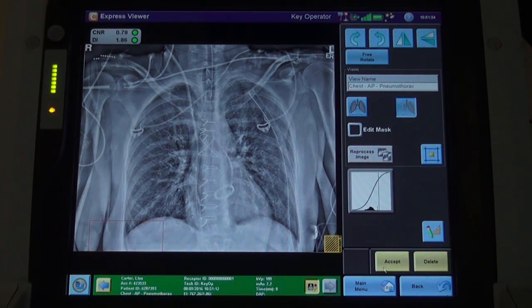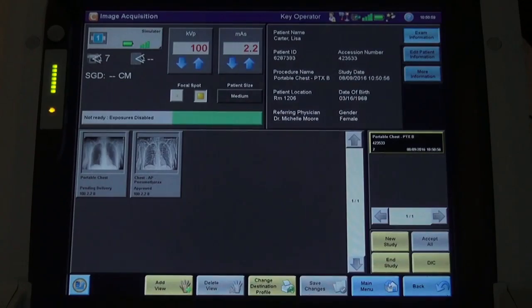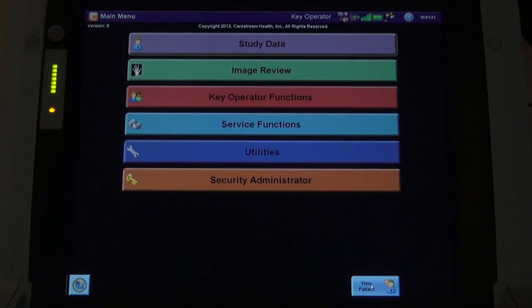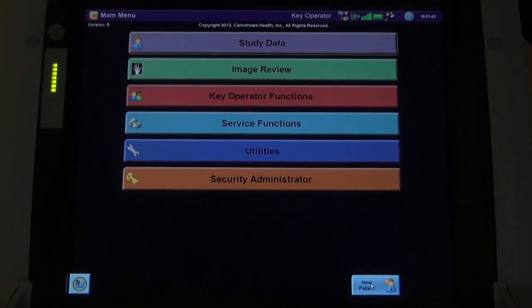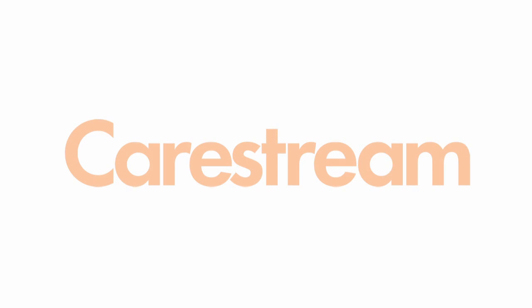Once they are satisfied with the two images, they select the Accept button and the images are queued to send to PACS. The radiographer can now navigate back to the main menu and prepare for the next patient.